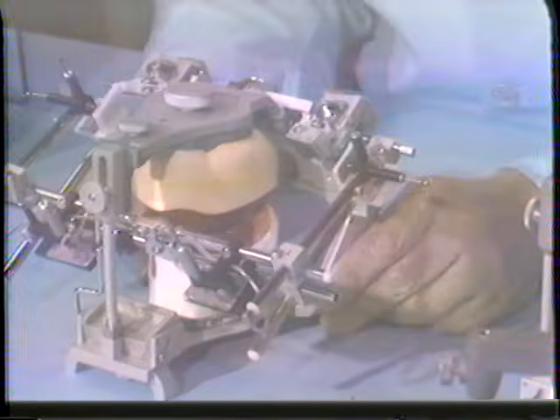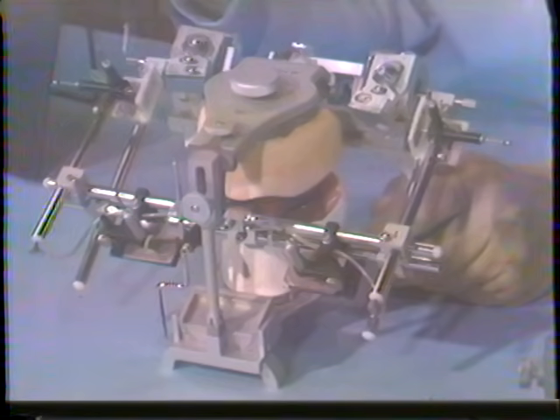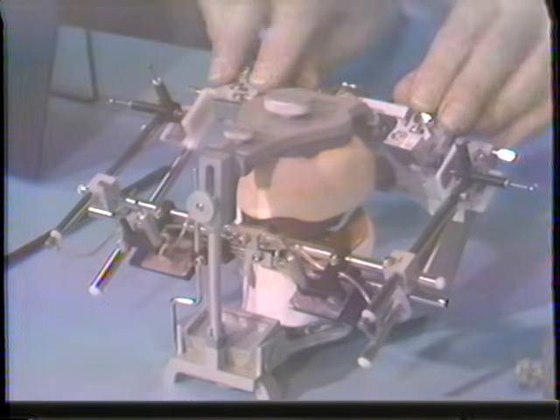Now we get 6 tracings. We get 2 on each side of the posterior elements and of course 2 anteriorly. This gives us much more information which we can put into the instrument now. The patient has given us more of the lateral movements, and we attempt to trace out these movements by adjusting the various guides of the instruments.